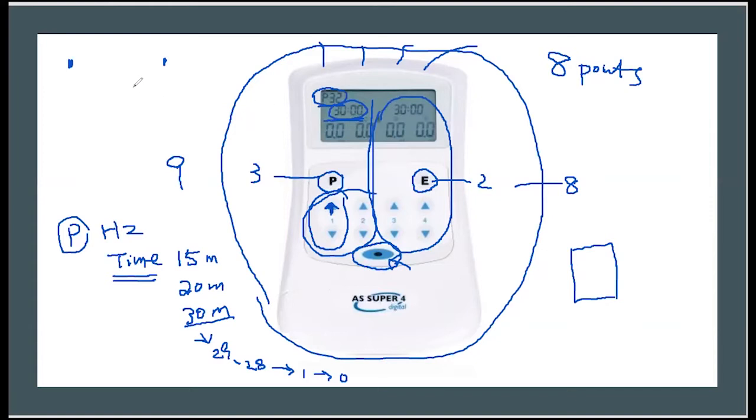Remember, when you connect the needles, turn the machine off first. Don't have electrical connected with the needles. So you put the needle there first, then you connect the wire with the machine, but during that time the power is off. Then whether you connect to the handle part or the body part, make sure they are truly connected there. Then you turn on the power.